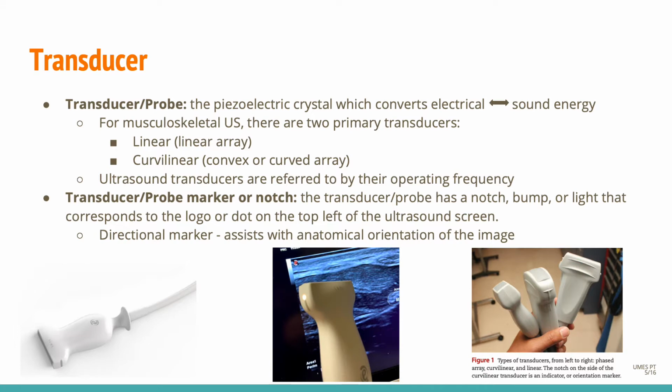A transducer probe marker or notch. The probe usually has a notch, bump, or light that corresponds to a logo or dot on the top left of the ultrasound screen. This serves as a directional marker. It assists with anatomical orientation of the image.